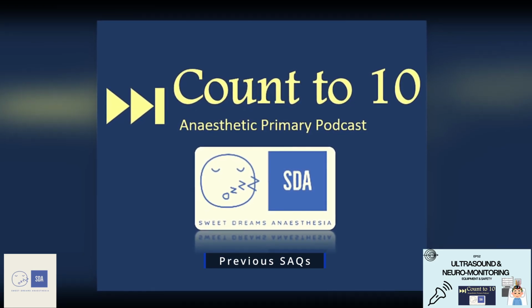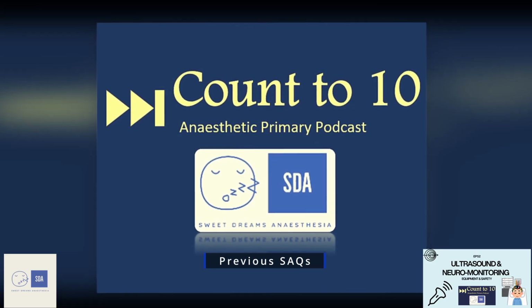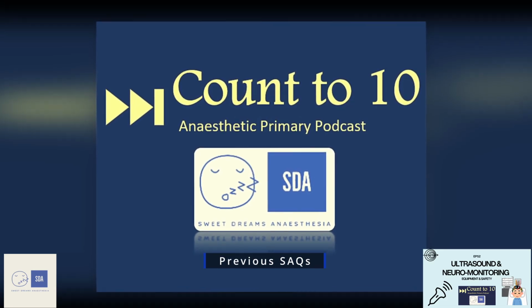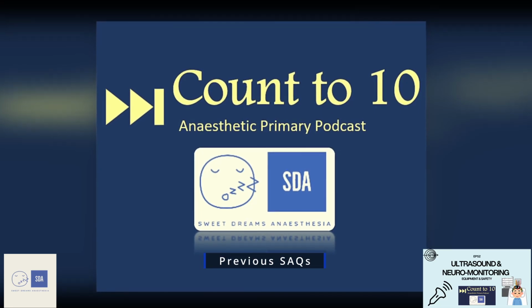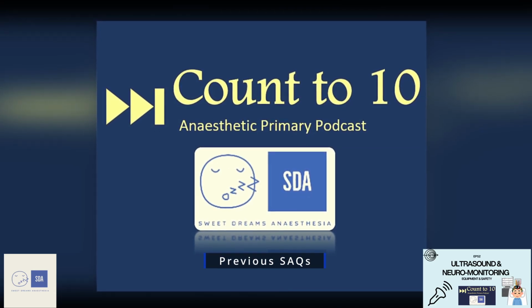From there on, I would move on to my next heading, which is the physics of ultrasound image generation and detection. And for this, I would start off with the ultrasound wave is generated through a voltage that is applied to the piezoelectric crystals, which creates a change in these crystals, releasing a mechanical pressure wave, aka a sound wave. Additionally, I would add on that these sound waves are produced hundreds to thousands of times a second, and that this allows for better image generation and detection of the ultrasound waves.